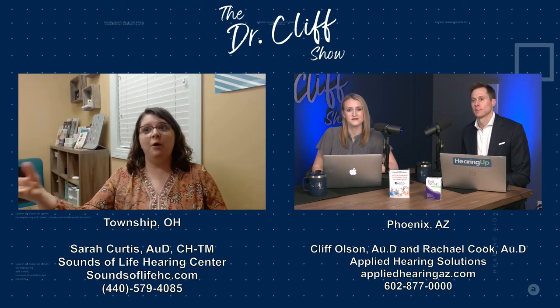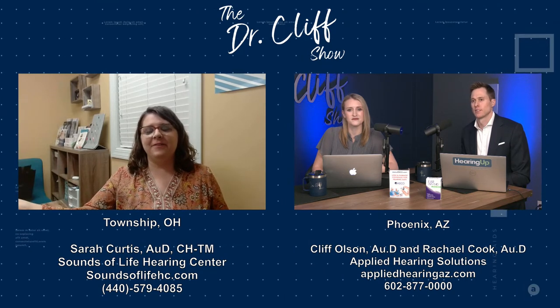Awesome. He came in, and we fit him with a pair of hearing aids that I love, but I did research a couple years ago. I don't know if you knew that, but I did this in-house research where I ran every single manufacturer in my test box to the same 4 hearing losses. And I looked at what they predicted the output should be for these hearing aids to fit them properly. And every single one of them was significantly under. Nobody was up to target. Nobody gave appropriate audibility.